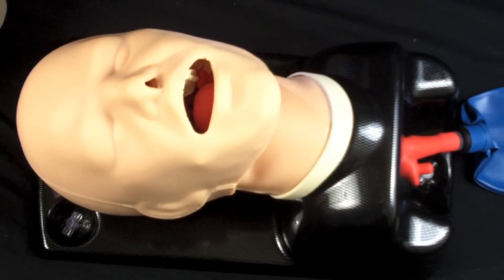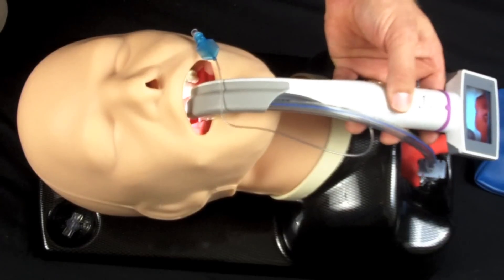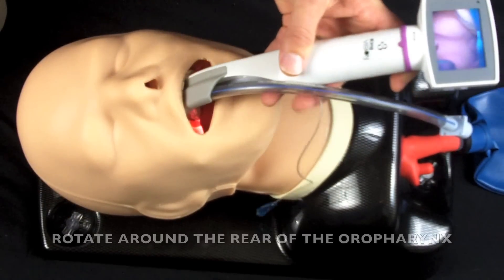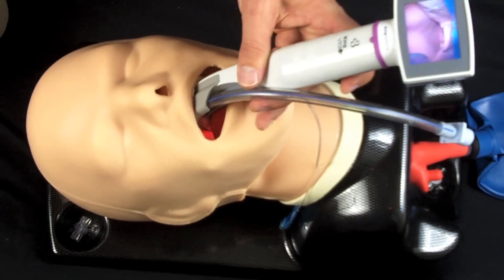Okay, now I'm going to do this intubation just a little bit slower so that I can show you some of the details that I'm looking at to make this work a little easier. You want to lay the blade down right across the patient's chest basically, and then roll it right around the corner of the rear of the oropharynx. Now if you take a look at the screen, you can see I'm coming up on the epiglottis.